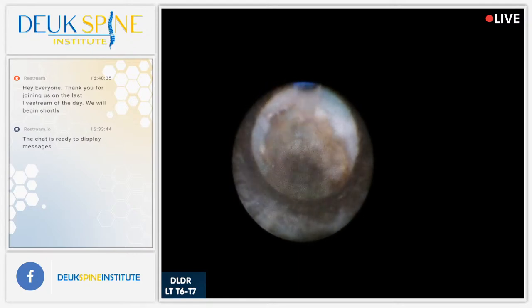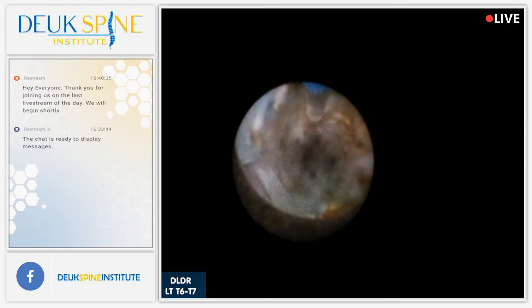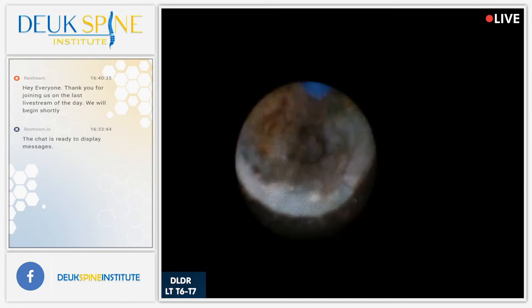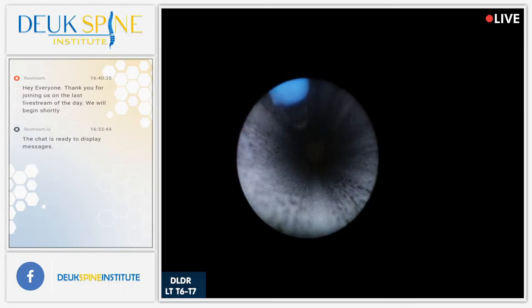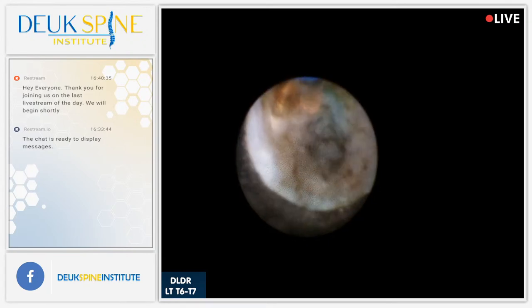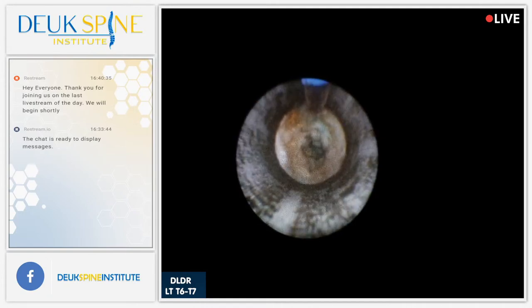Okay, just about done here. This is the last of the herniation. I'm almost at the end. We've cleaned it all out. The annular tear has been cleaned out. Oh, now it's squirting like crazy. Oh my gosh. Whatever you did, holy mackerel, it's blowing. No, it's good. Back it off a little bit. Something happened. Wow.